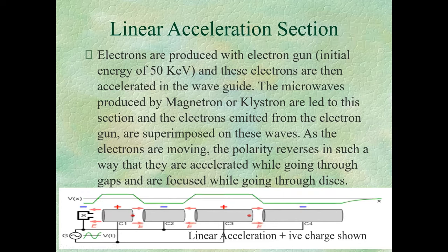Then electrons, for treatment with electron beam, as the electrons exit the window of the tube, the beam is again a two or three millimeter diameter beam. They are made to strike the electron scattering foil. So instead of a tungsten target, here the electrons strike a scattering foil. The target is removed and the scattering foil is moved in. The scattering foil spreads the beam and helps get a uniform fluence across the field.